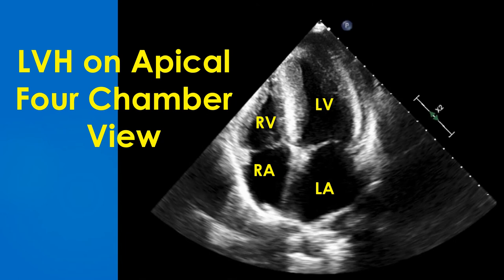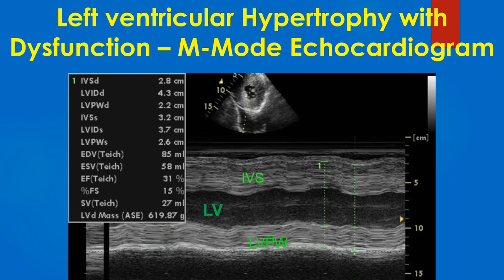Apical 4-chamber view showing left ventricular hypertrophy. The left atrium seems to be a bit dilated, probably secondary to LV diastolic dysfunction in LVH.